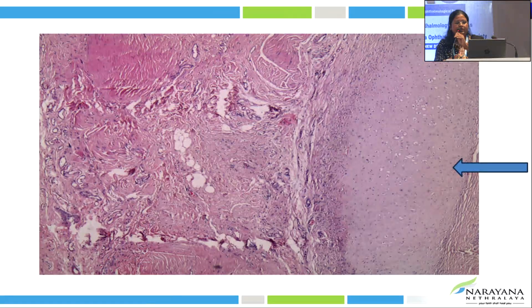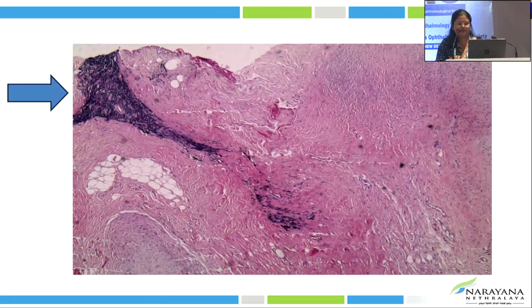And when I looked into the microscope, what did I see? I saw a large cartilage, some fibrous tissue and fat there. Again, the whole biopsy was like that: cartilage, fat, some non-specific ducts, and then only one small part had some crushed cells.